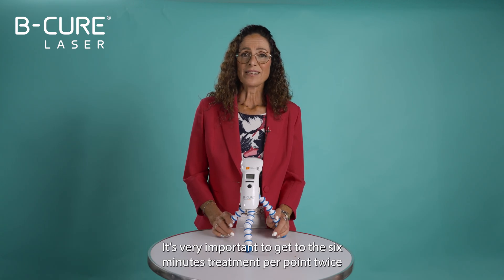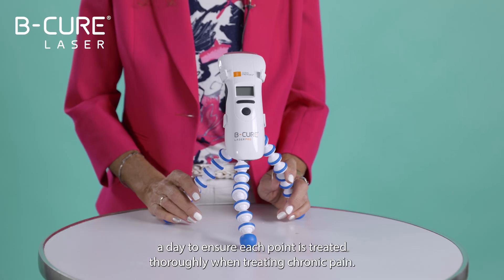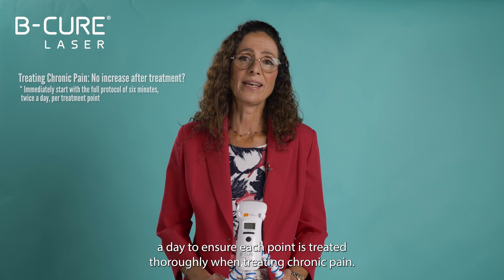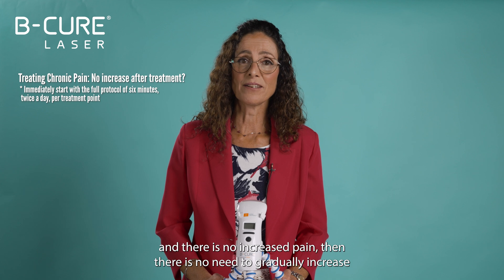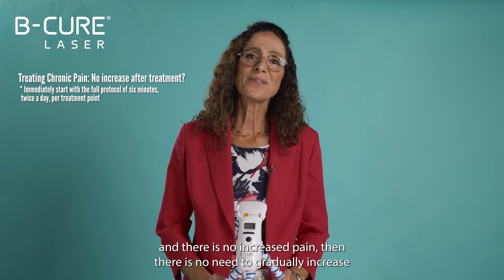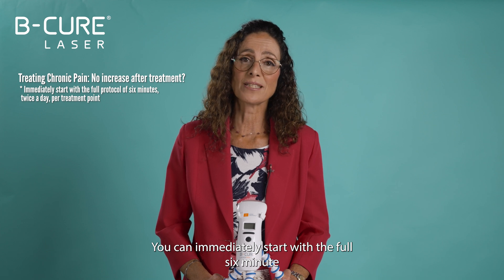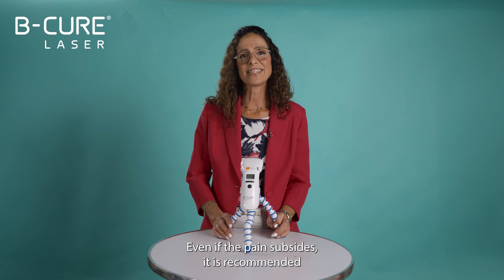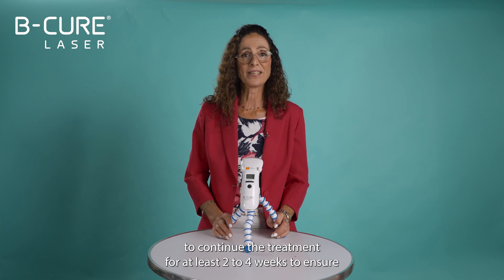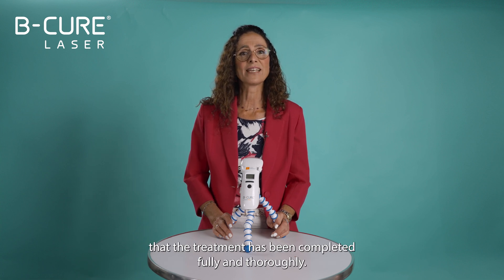It's very important to get to the six-minute treatment per point twice a day to ensure each point is treated thoroughly. When treating chronic pain, if you perform the first treatment of one and a half minutes and there is no increased pain, then there is no need to gradually increase the duration as there is no inflammation present. You can immediately start with the full six-minute treatment twice a day on each point. Even if the pain subsides, it is recommended to continue the treatment for at least two to four weeks to ensure that the treatment has been completed fully and thoroughly.